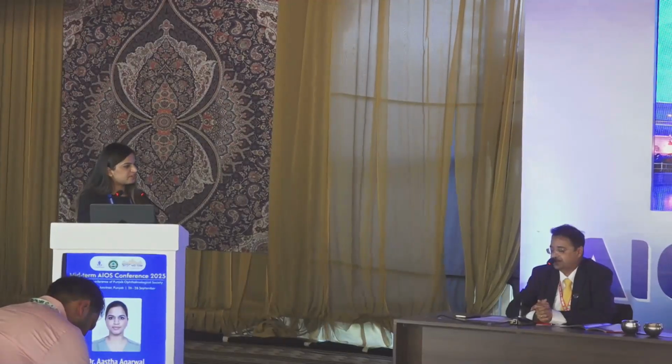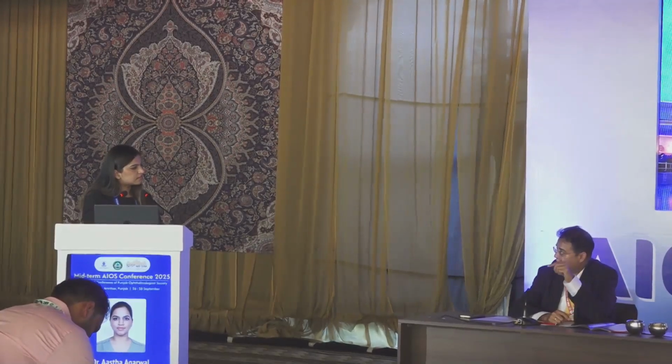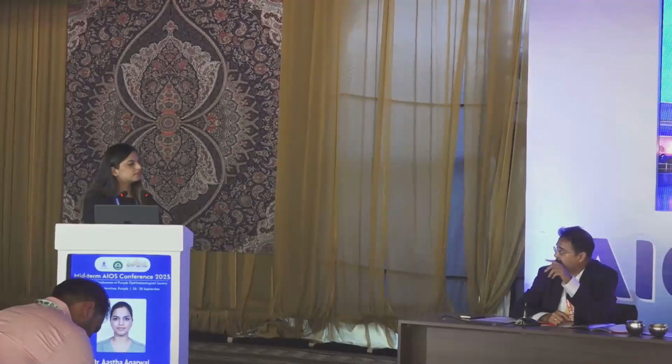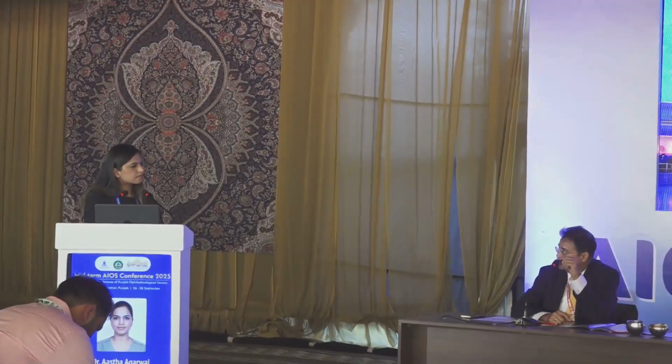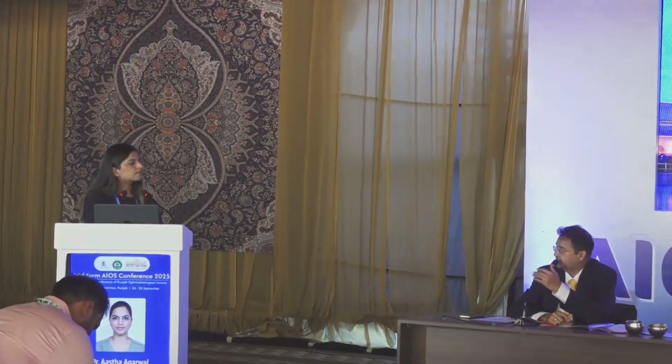Peripheral iridectomy? No. So basically, you do a vitrectomy. Initially, your IOP will get controlled, but the patient will get frequent attacks of malignant glaucoma. To control that, we do have to do a YAG or surgical laser hyaloidotomy with vitrectomy and zonulectomy. So you have to create one chamber from iris, zonule, anterior hyaloid, and vitreous. Then the frequency of repeated attacks will reduce. Fine. So it's a good case, well documented, very nicely managed.